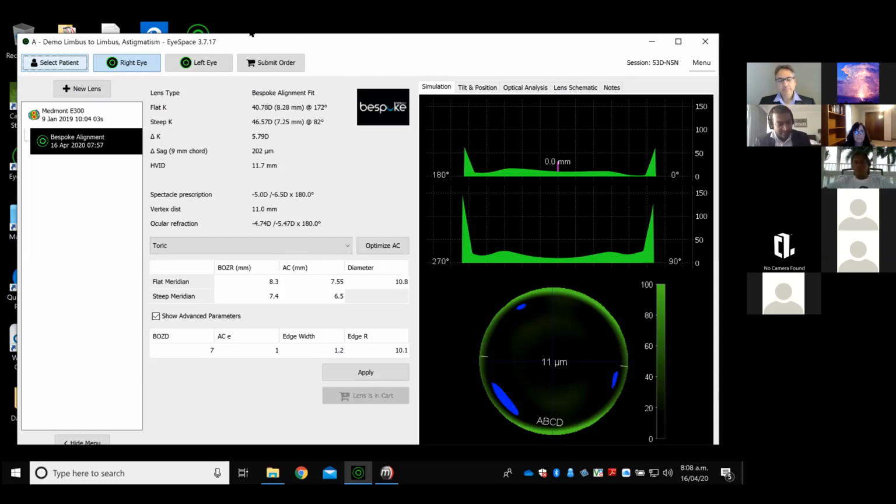And so the higher the cylinder, the less give or less laxity you have in your system when we do the calculation for residual cylinder. So if your cylinder is set at 180 degrees, but you've got 172 degrees where the actual corneal axis is, then that's going to magnify the effect as the cylindrical power goes up in terms of the error. So then you're going to get misalignment. This wouldn't matter so much if it was a lower degree of cylinder.